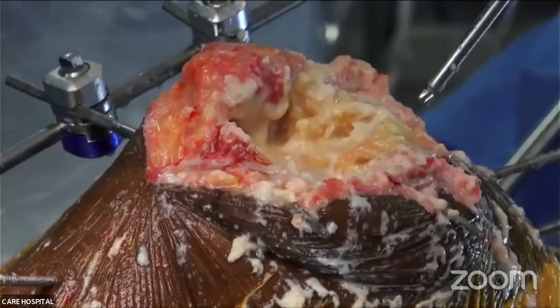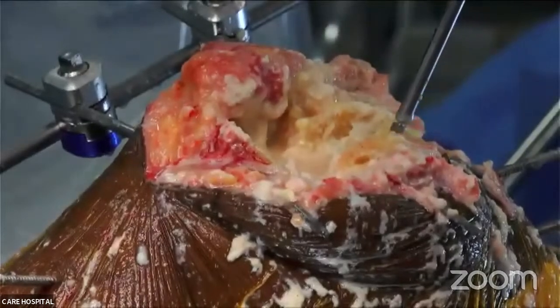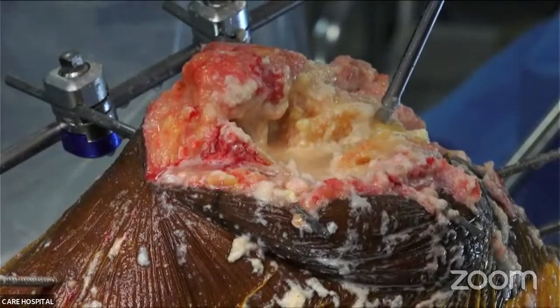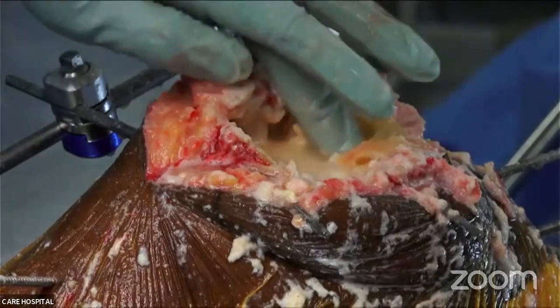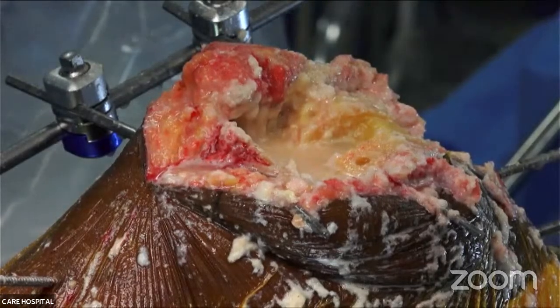The size of the femoral implant is decided on the CT planning. And if we want to change it, upsize or downsize it, we can do that in real time. CR we have not done. So that completes all the cuts. Now we'll take off the robo.